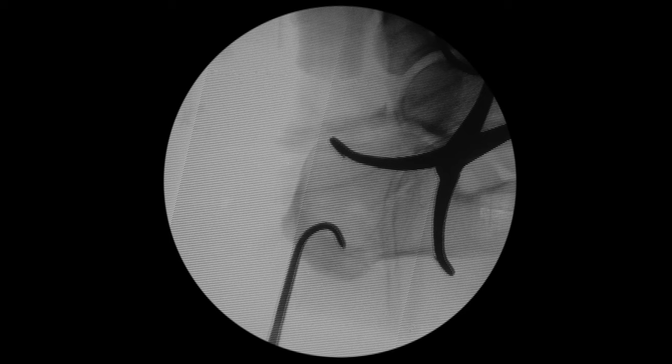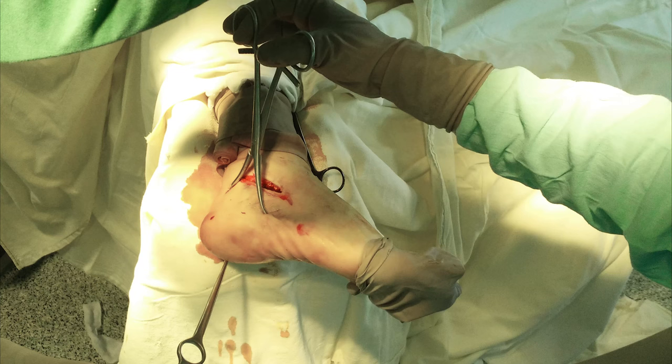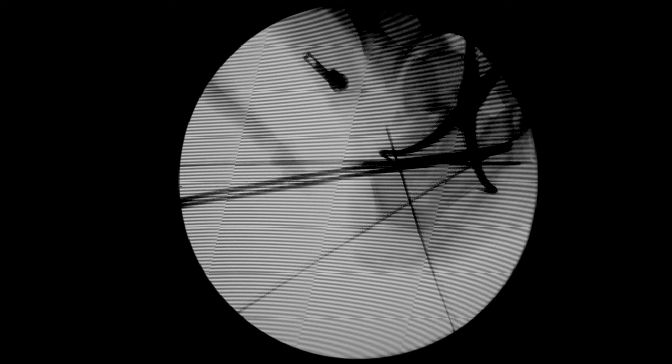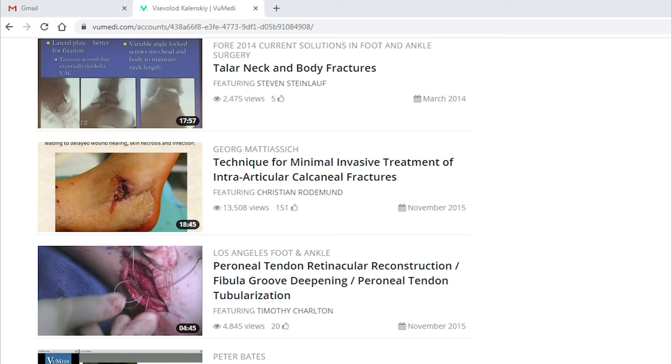One incision was to the plantar surface of the constant fragment, and another to the upper surface of the tongue fragment. Through these incisions, a bone clamp was introduced and the tongue fragment was reduced. After reduction, provisional wire fixation took place. Then two thick wires for cannulated screws were introduced. We used Synthes 6.5 mm full-threaded screws.